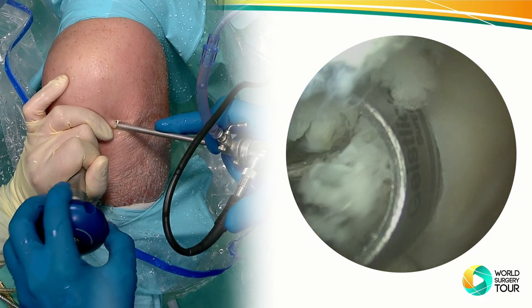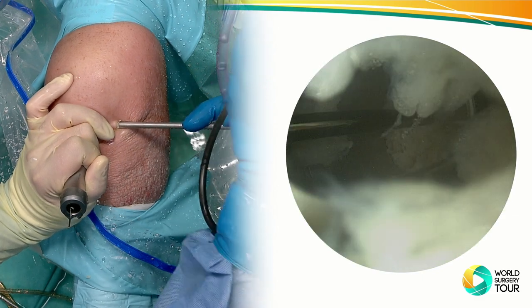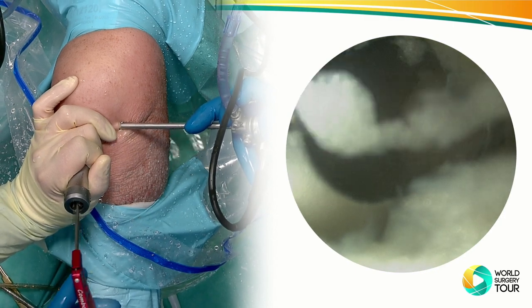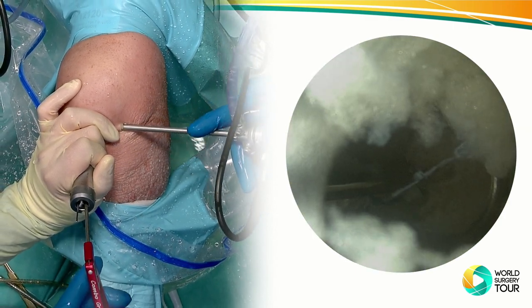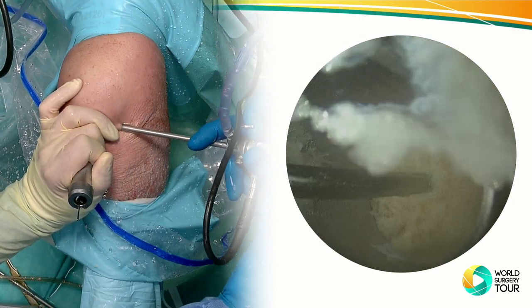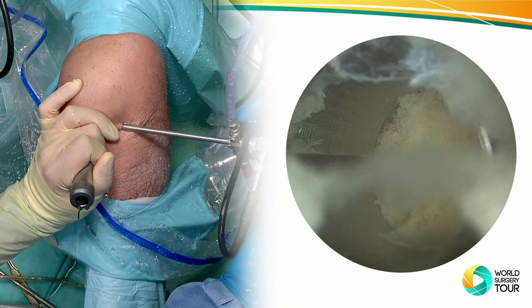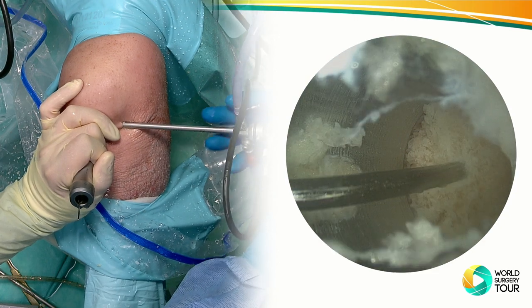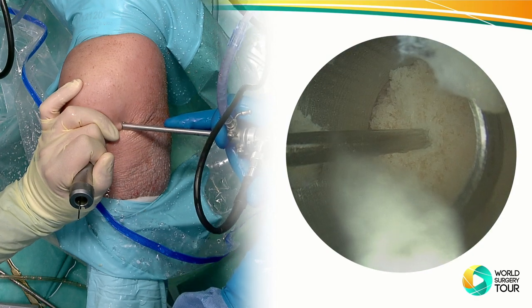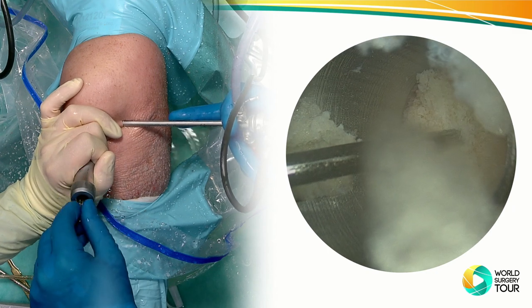Okay, let's remove it again. And I'd like to have the grasper again. Now, when there's no water, you can remove it. As you saw, there was water in there, or I had the suction on, then you get lost, but we already harvested enough cartilage. So that's why it's actually suggested that when you do the reaming, this should be done without any fluid in the joint. All right, as you can see now, we are already at the subchondral bone. Looks actually pretty fine. Looks great, yeah.